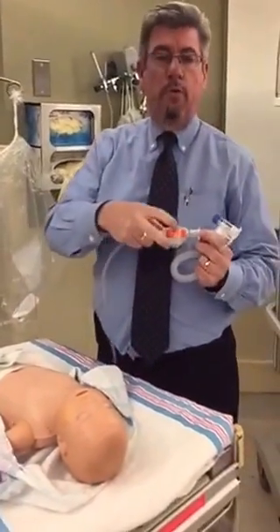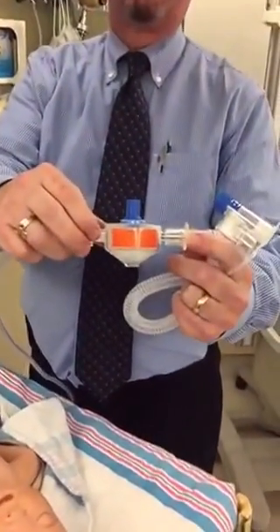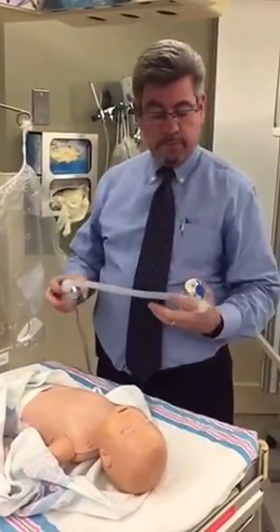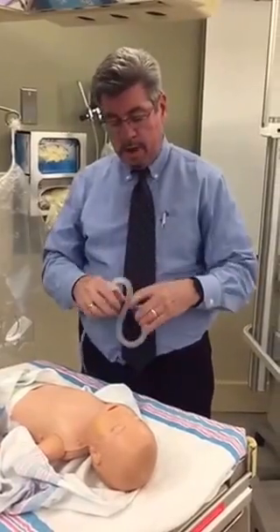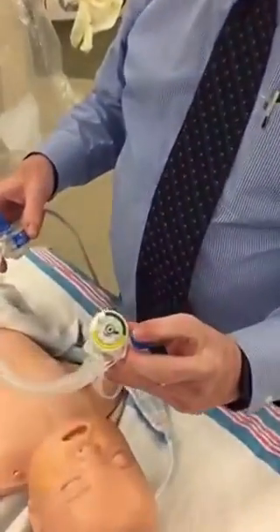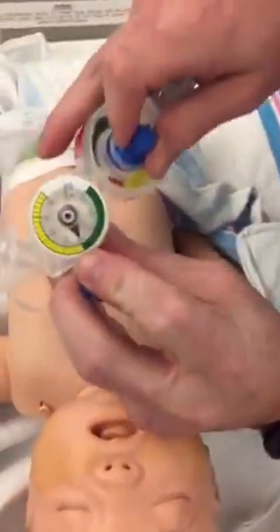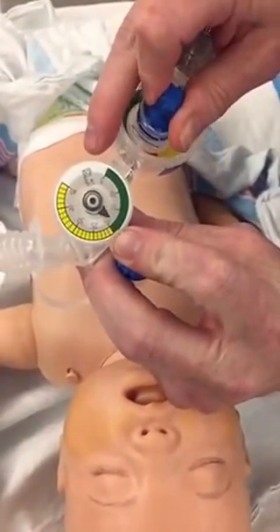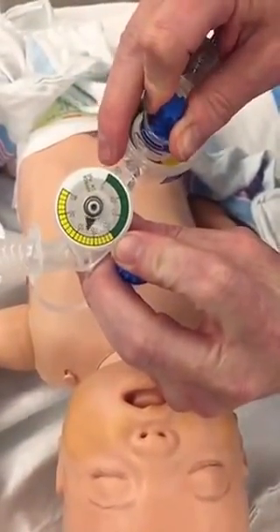Those PEEP settings you can actually get right on the side of the device as well, so if you have different needs you can have those available and you can use different flow settings. Now that I have the device flowing I'm going to set my PIP first. I'm just going to occlude that and you can see that by turning the dial on the controller I can modify the PIP pressure.